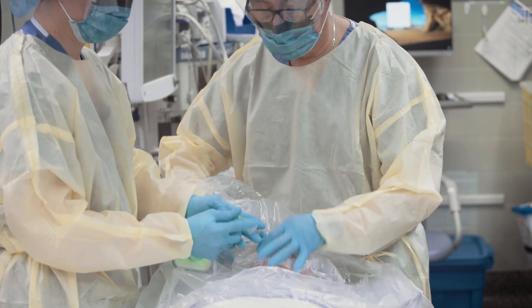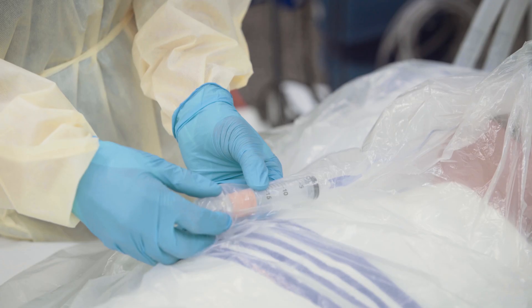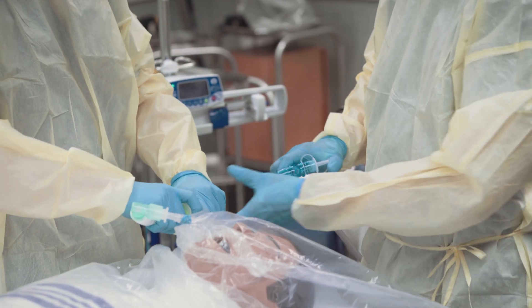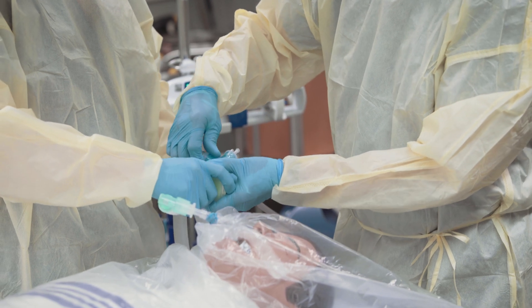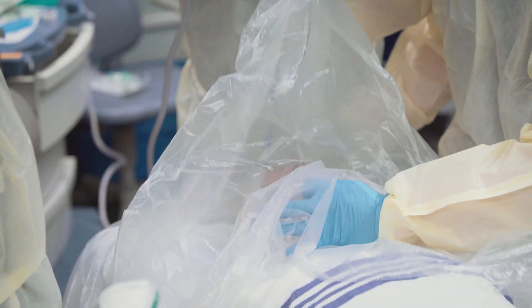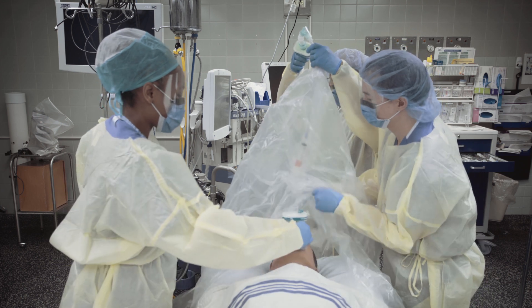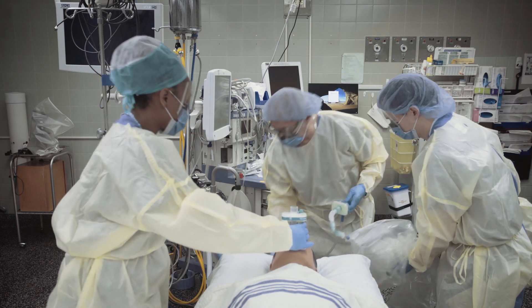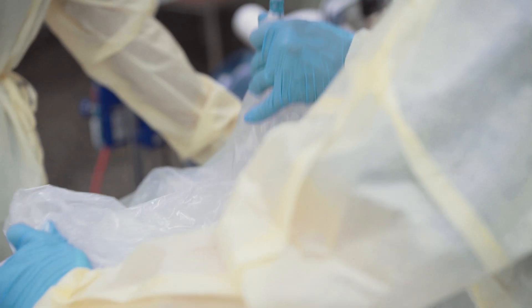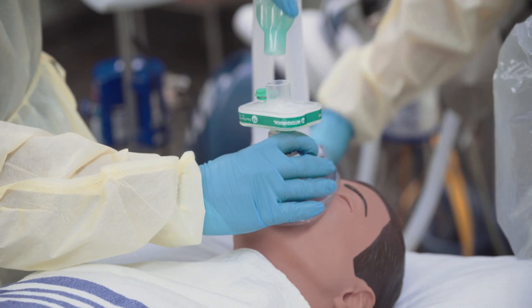When the patient is fully awake with all reflexes returned, the tape is loosened and the tube cuff is deflated beneath the plastic cover. Extubation is performed with continuous suction at the connector near the filter attached to the tube. Slowly lifting the plastic cover off the patient's mouth and face creates a negative pressure-like tent. The pliable plastic cover is then closed immediately, wrapping it around the tube while an assistant immediately covers the patient's face with a tightly fitted mask with filter.